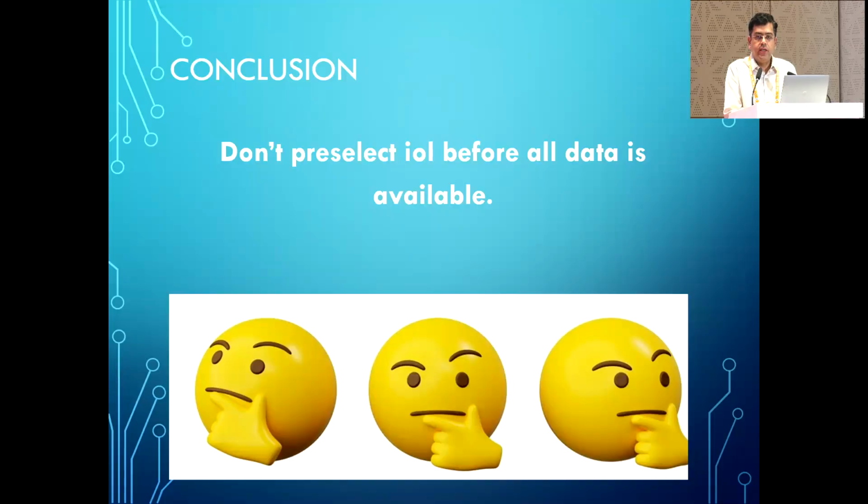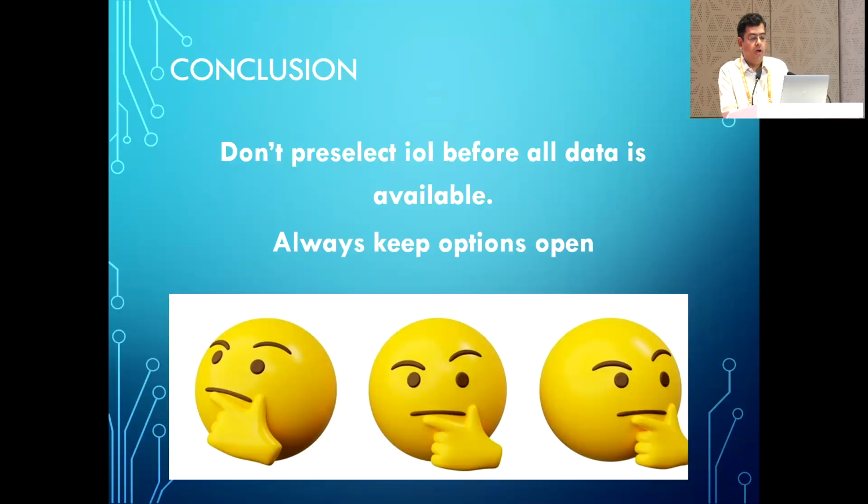So the conclusion is, don't pre-select your lens. Somebody walks in, a rich patient, and you think this patient is a computer engineer, so we are going to do this lens. Don't pre-select the IOL before all the data in your clinic is available, because only with all the data, from the cornea to the biometry and what surgery you are planning, can we choose the best IOL for the patient. Always keep options open. Thank you.